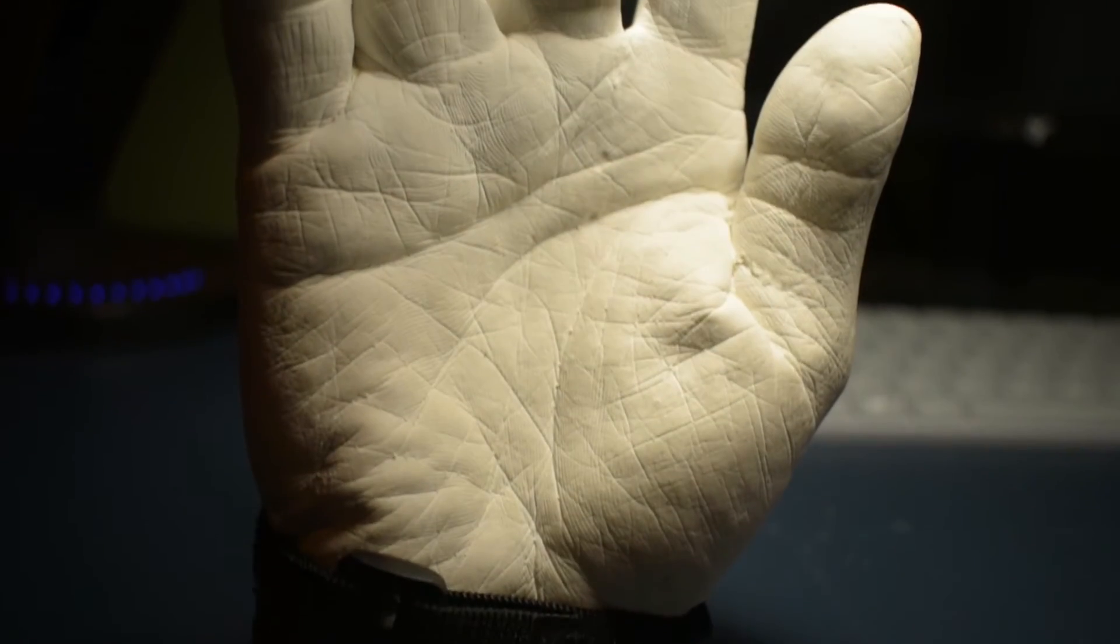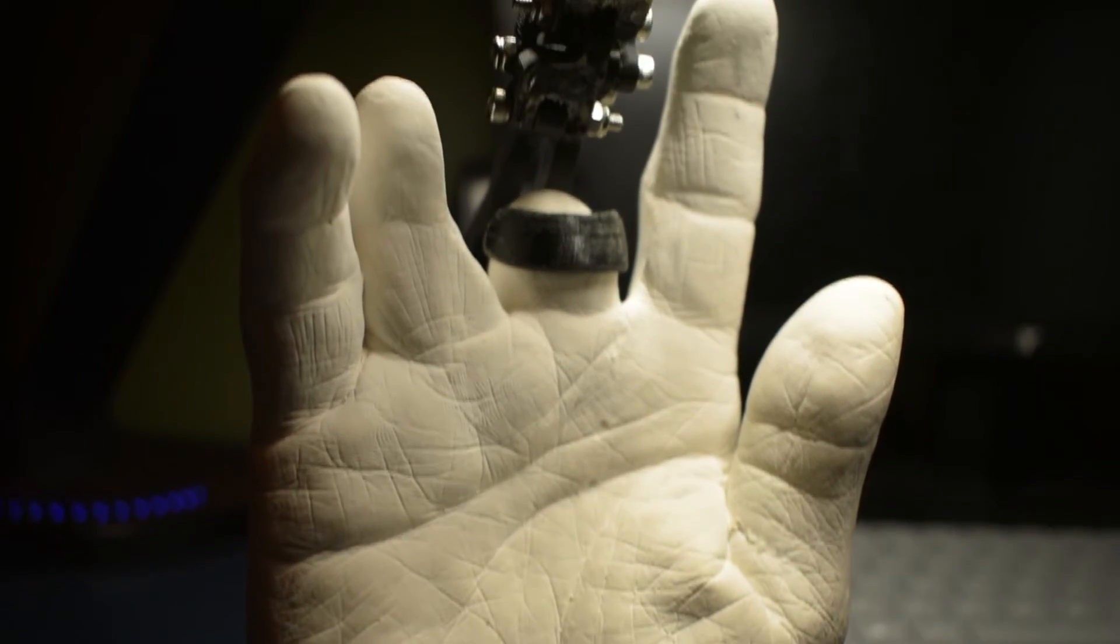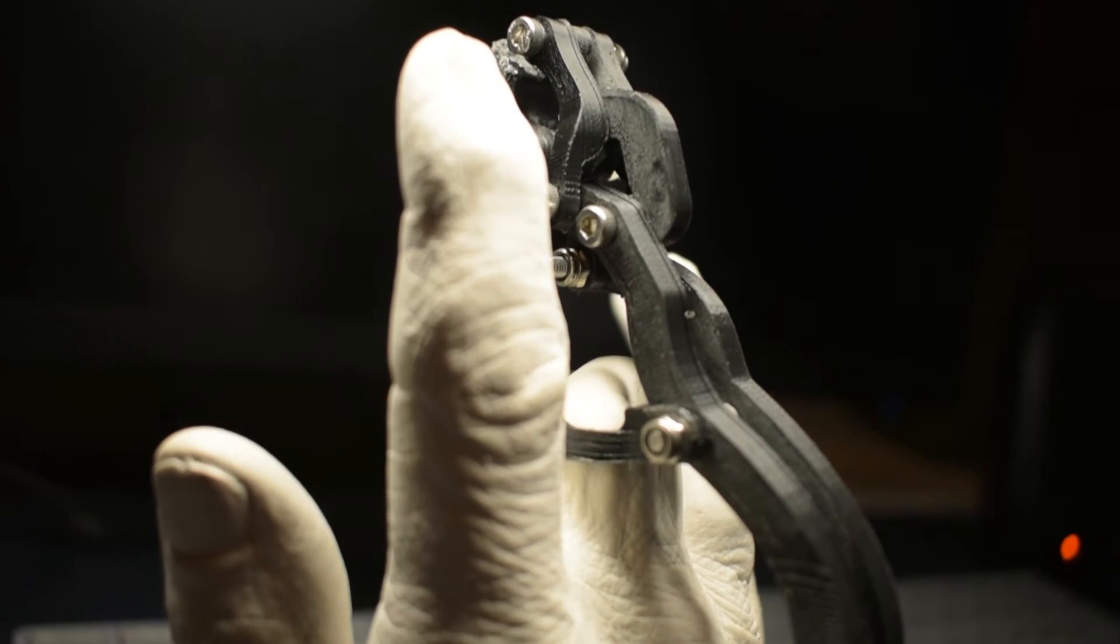After the final version of the prosthetic finger fit my alginate mold well, it was time for testing.